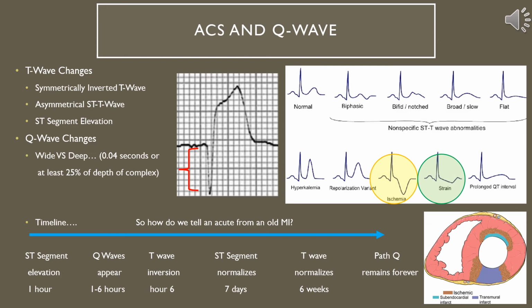It can be really irritating when you're looking at an EKG and you jump right to that little comment box, because you see it over and over and over, and it seems like, well, is there an EKG without non-specific ST changes? But when you're looking at it, you want to look in more than 1 lead.